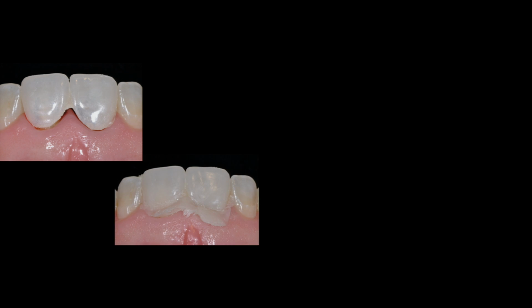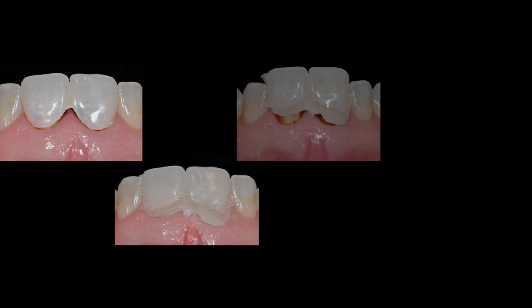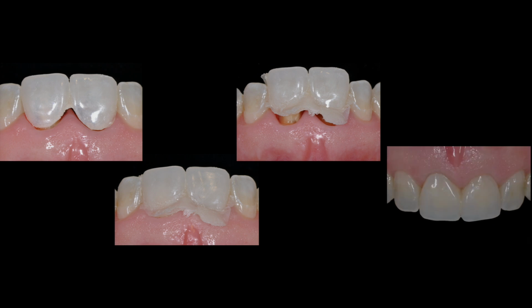And now, as we design the 2 crowns, the design is going to be affected by the technology that we have. So we move forward and we place our provisionals, and to me, the provisionals that we're using are going to be a key for the design and fabrication of the definitive restoration.